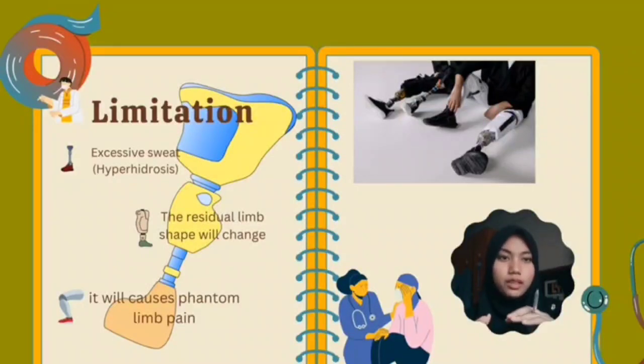of the things that contribute to the leg prosthesis can actually be affected because the size of the residual limb has changed. Consequently, it can lead to harm at the socket, and the actual design of the socket will slowly become dysfunctional, which means that there will be an increase in injuries of the missing limb and it will disturb the blood flow at the part of the residual limb.